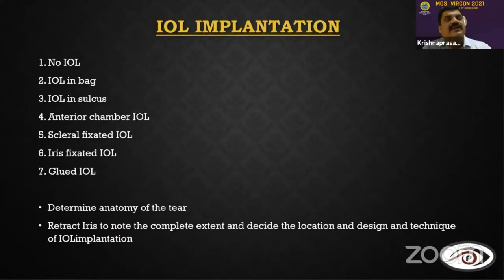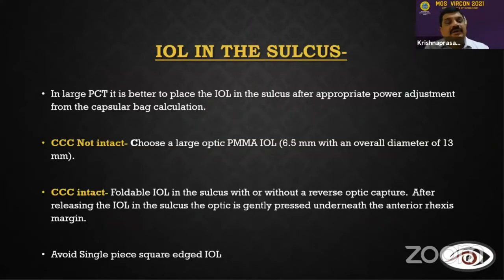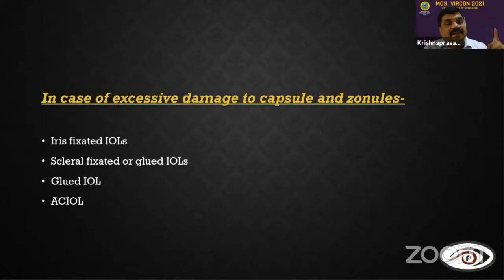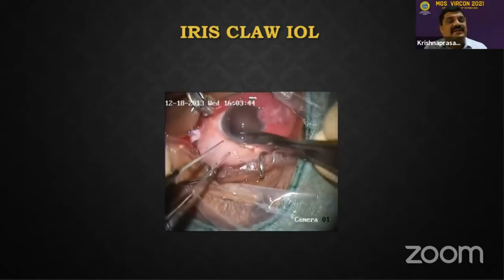Sometimes, even in our olden days, we never used to put lenses, but most of us now have switched to scleral fixated IOLs or glued IOLs. So IOL in the bag if the rent is very small; if the rent is big, you can put the lens in the sulcus, but make sure that you put pilocarpine at the end of the surgery. Then in excess damage to the capsular zonules, you can do this technique, iris claw lenses.